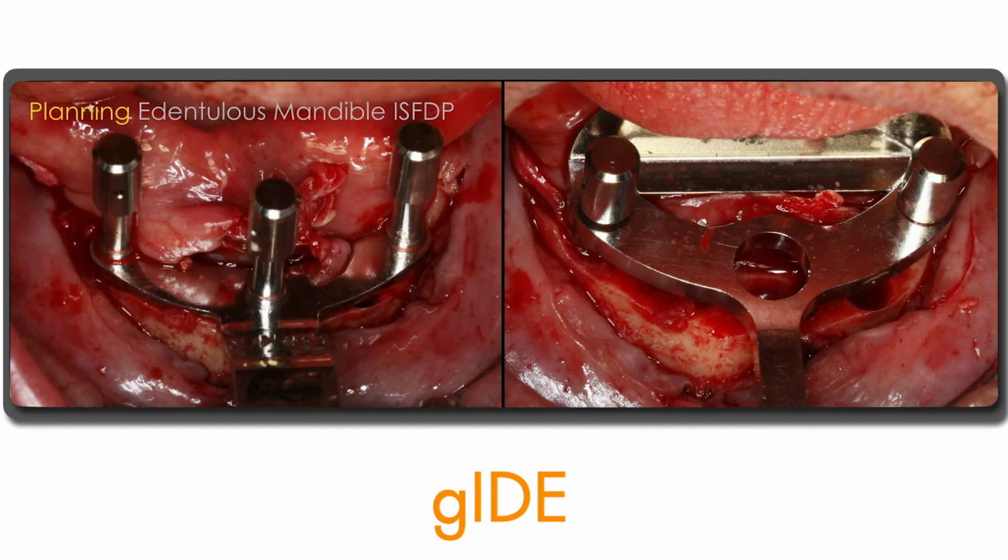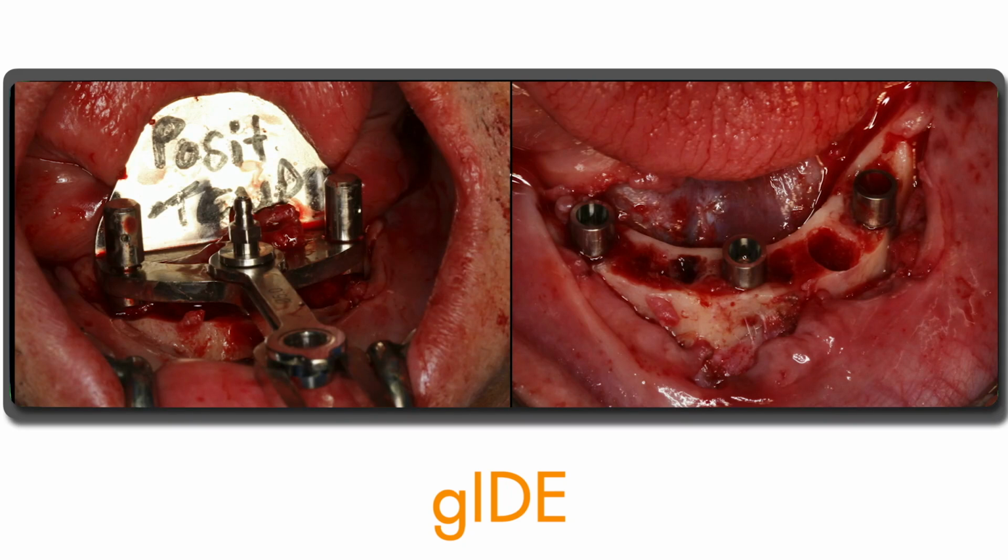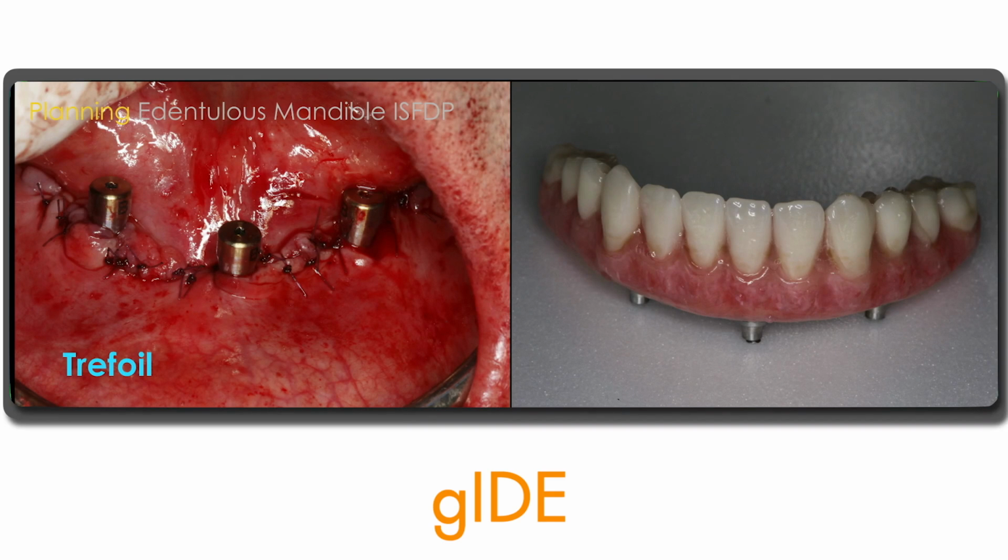You'll see the implants are now being placed with this template, and there are the implants in position. So using the template guides you for the position of those implants. Here we have the patient with the healing abutments in place, and this is the final bridge that was issued to the patient the following day.